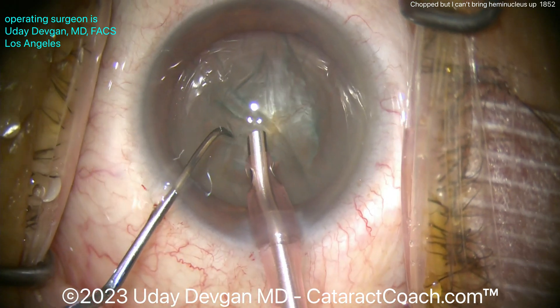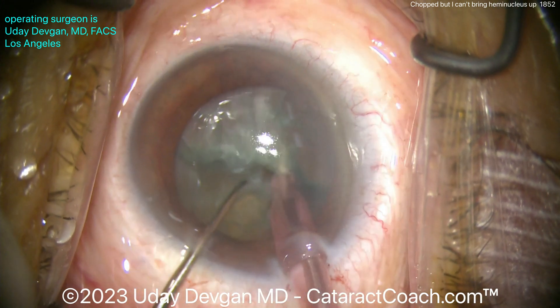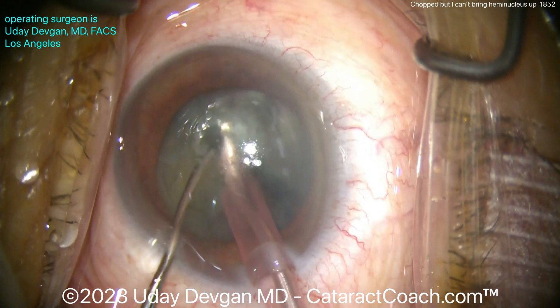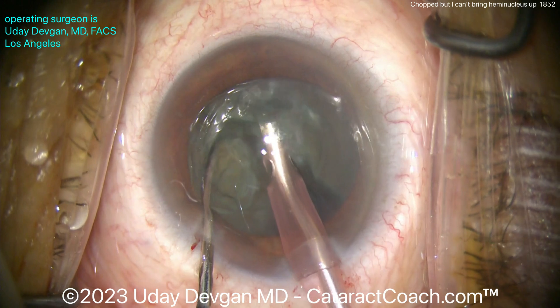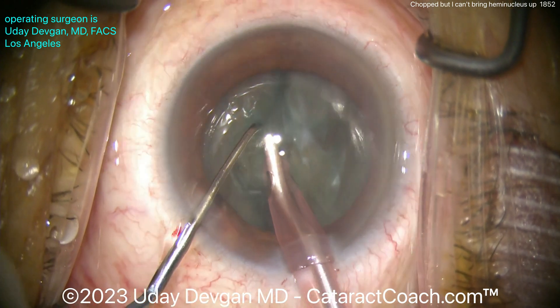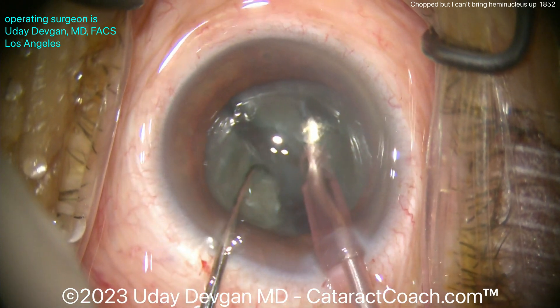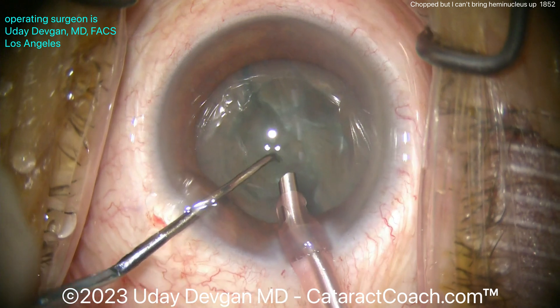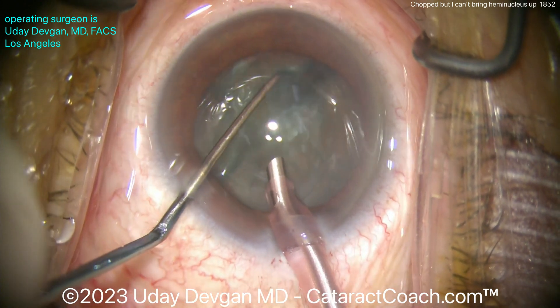Take that bubble out so we can have a nice video, and buzz into the nucleus. Then place the chopper, combo chop and split it — there you go, propagate that through. Now I'm using the left-hand chopper to hold a piece; one hand goes away while the right hand tries to bring up one half. It didn't work, so try the other piece — let me go on this side. There you go — all right, there's two halves. Let's rotate it around again; maybe I'll try a fresh corner.